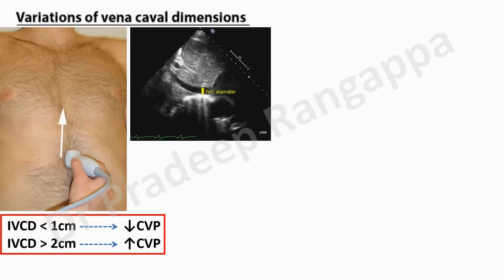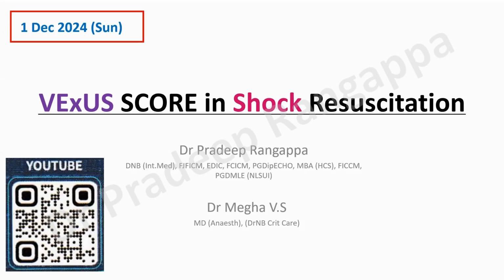As you know, just to give a background, we have a lot of tools to assess fluid responsiveness. But we need tools to ascertain fluid adequacy and when to stop resuscitation. Most of the cardiac output responsiveness to a fluid bolus, which we call fluid responsiveness, measures the forward flow.